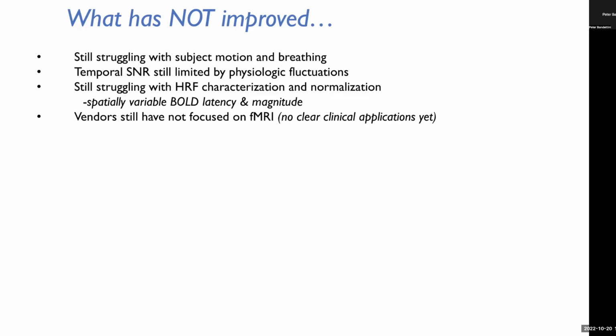Vendors, and this is an important point, really drive most of even the fMRI technology, even though they don't really care about fMRI. We sort of piggyback on their systems, which has actually allowed fMRI to spread, but at the same time, they haven't focused on fMRI because there's no clear, robust clinical applications yet. So they haven't spent much time trying to develop and optimize it. Scanners are still loud and confining. MRI is, of course, still expensive, which is another impediment to making fMRI more clinically applicable.